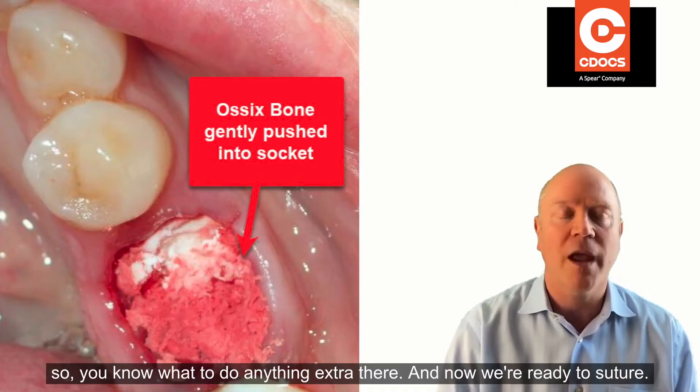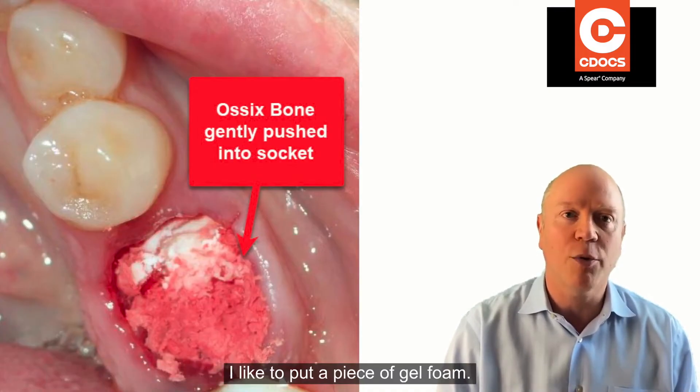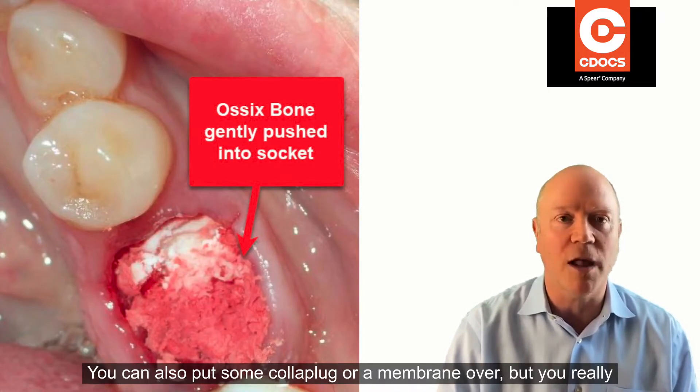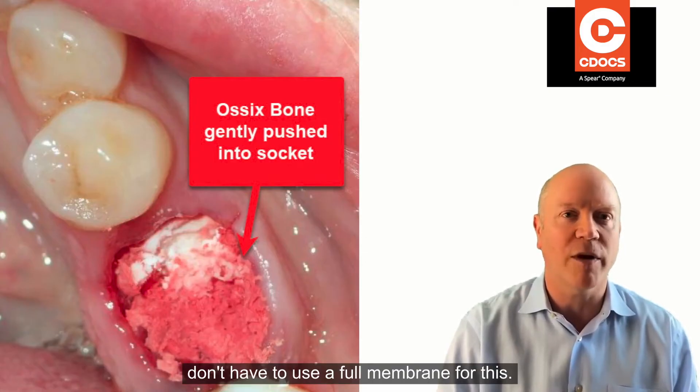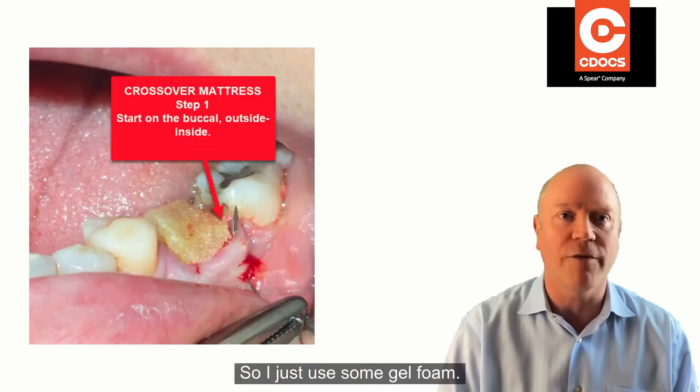You don't have to do anything extra there. Now we're ready to suture. I like to put a piece of gel foam — you can also put some collagen plug or a membrane over it, but you really don't have to use a full membrane for this. I just use some gel foam.